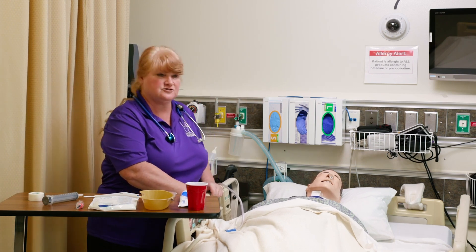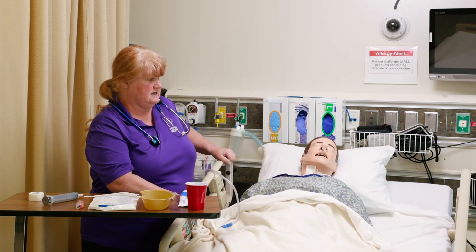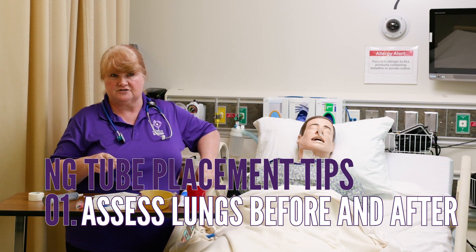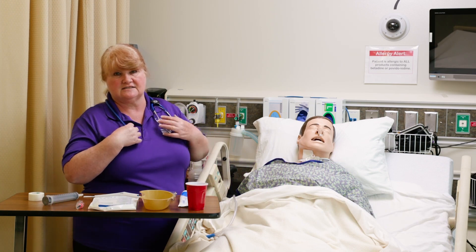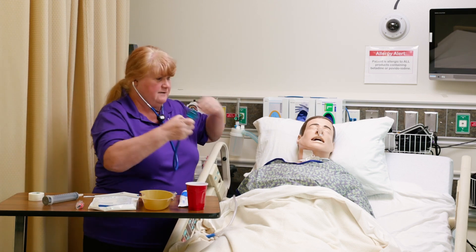You will have your patient in a high Fowler's position before you put the NG tube in. You want to make sure that you assess the lungs before and after — you do not want to get the NG tube into the lungs and cause aspiration pneumonia. So we're going to listen to the lungs, then we're going to listen to the abdomen.